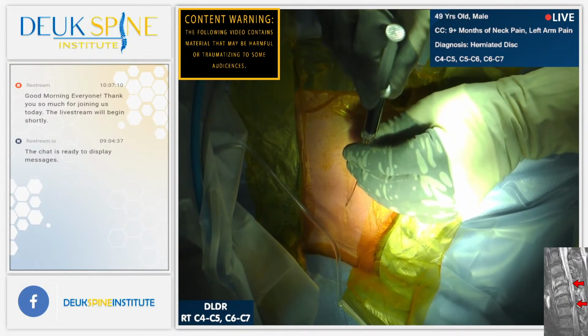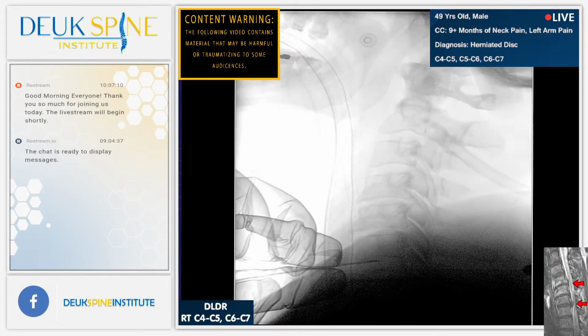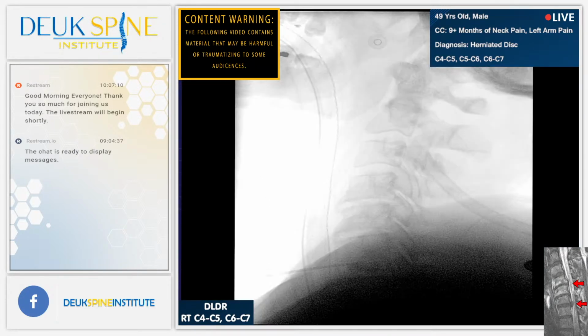This is it, right here, Luis. Our first patient is having a 2-level cervical Duke laser disc repair.